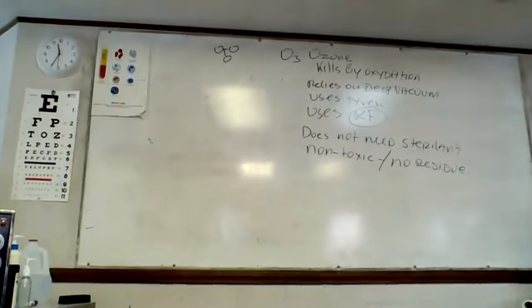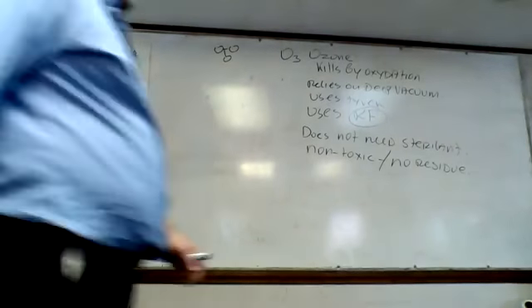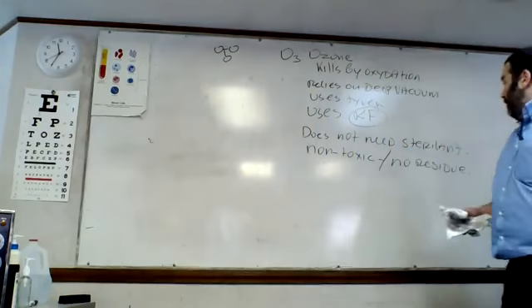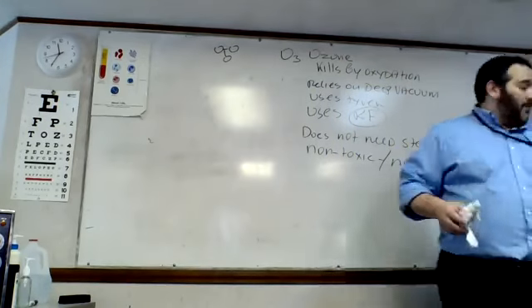Now a little bit more about ethylene oxide that I neglected to mention. What does that last line say? Which one? The last line. No residue.